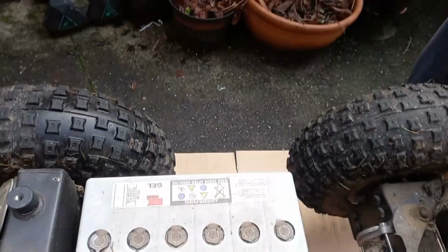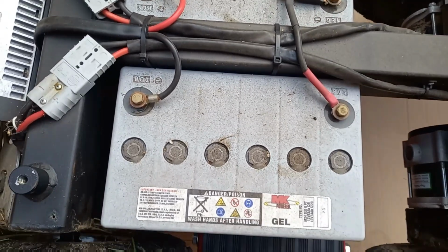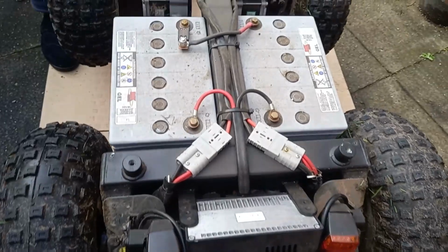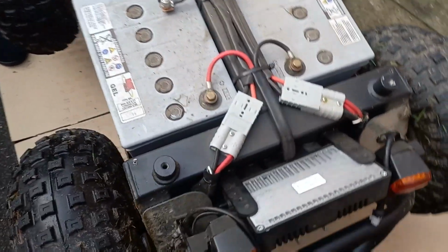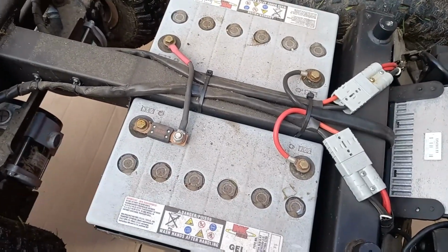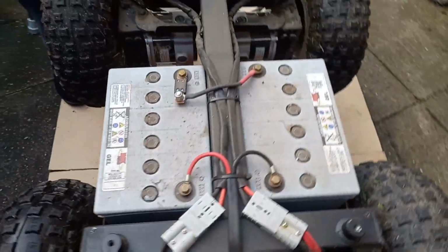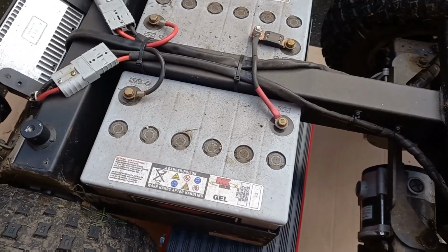So these batteries, the ones I'm replacing them with are exactly the same, MK, very good, made in USA. Very, very good batteries. I'll be honest with you, this machine is 7 years old now. I bought it with 18 miles on, and it had been on charge all its life, and as far as I'm aware, they are the original batteries. I've used it for 18 months, thinking they're probably not quite as good as they could be, but it's done another 18 months, and now, with the cold weather, it's got to the point where it won't go very far, so it's not good enough for metal detecting.